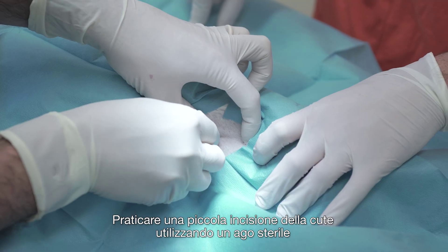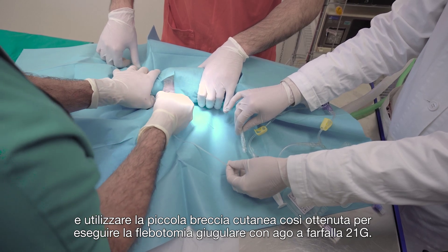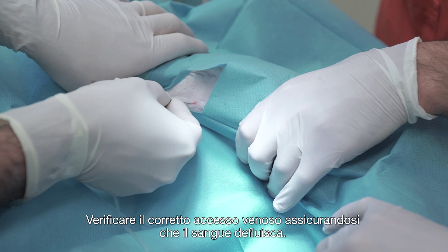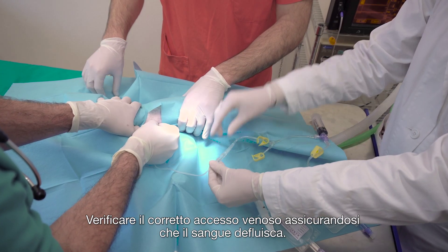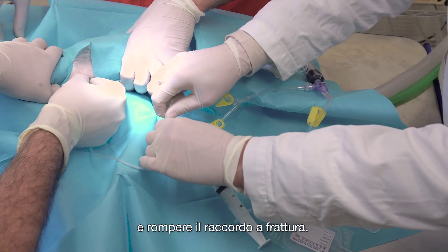Make a small skin incision by means of a sterile needle before performing the jugular vein venipuncture using a 21 gauge butterfly needle. Once the needle is correctly inserted, look for a flashback of blood at the catheter in order to verify the successful hit of the vein. Connect the butterfly needle to the luer lock connection and break the valve for tubing.